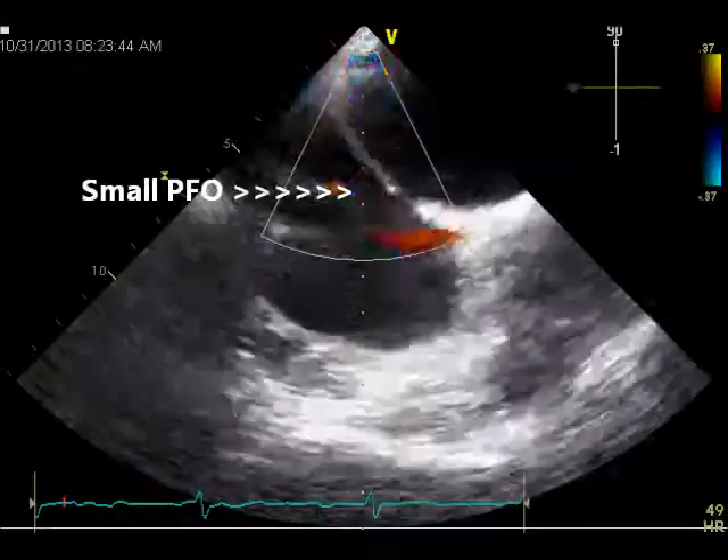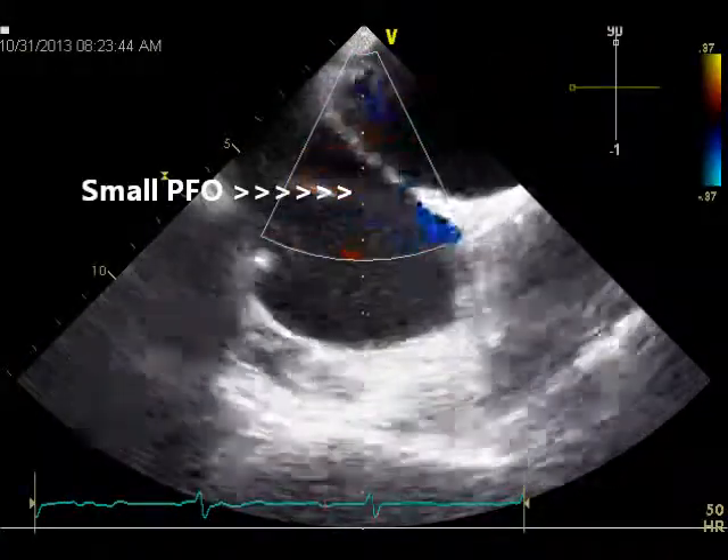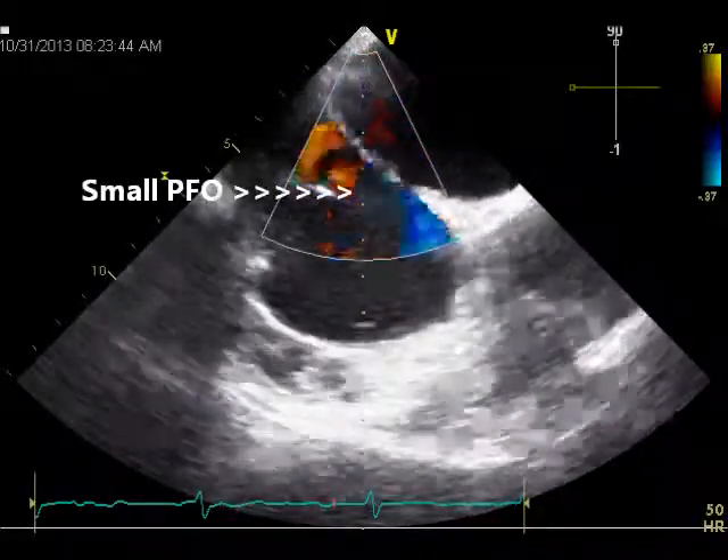Incidentally, a small PFO was also identified, which will be taken care of by our vertical transeptal approach.